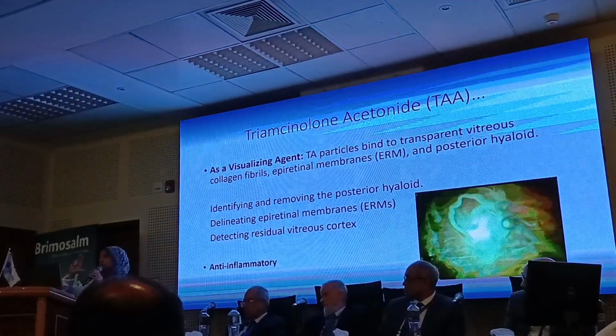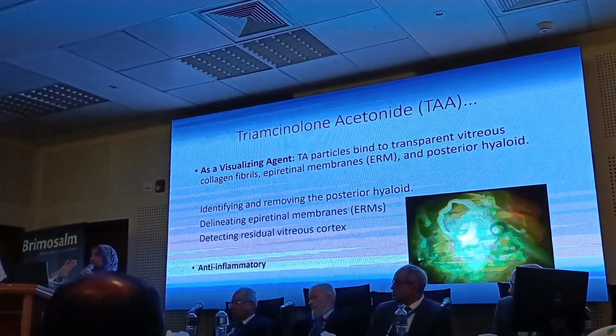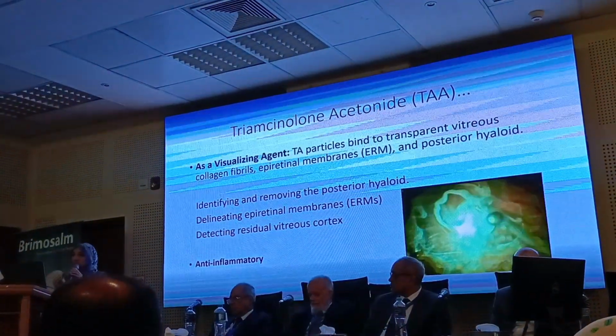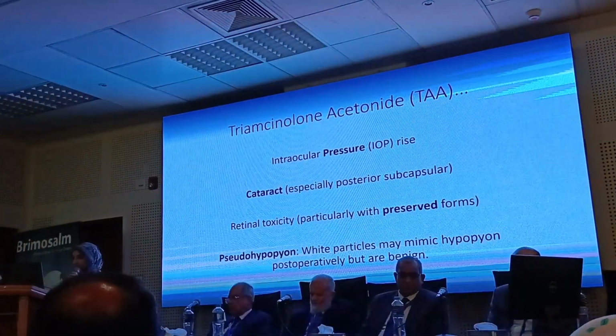And then we're going to remove all the fluid on the top, and then add 2 to 3 cc of the irrigating solution, and then inject it intraocularly. All this just to remove the toxic effect of the alcohol base in this solution.